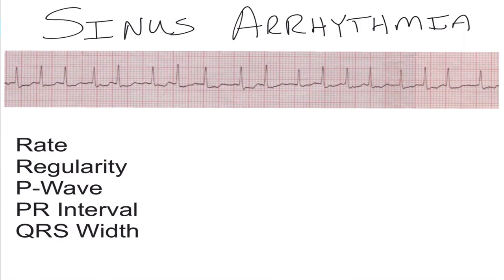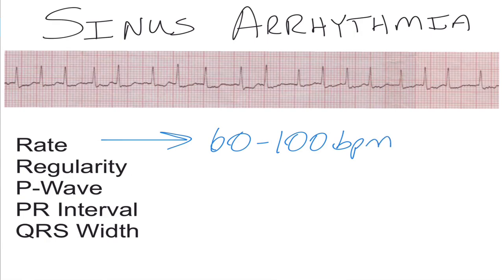So let's take a look at some of the characteristics of the sinus arrhythmia. You'll note that the rate is going to be generally between 60 to 100 beats per minute. You'll notice in the strip above that it's a little faster than 100 beats per minute, and that's because this strip was taken when the person's respirations were increasing.